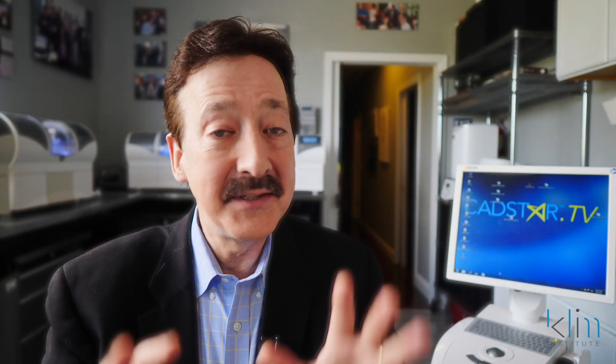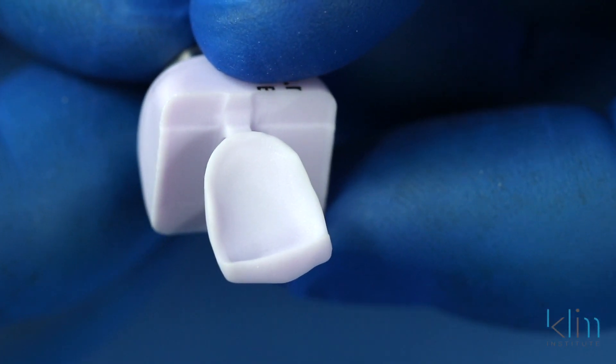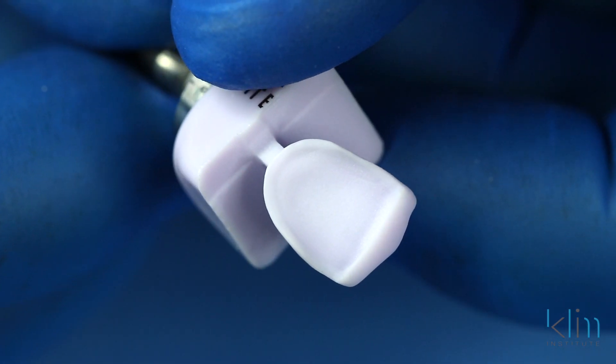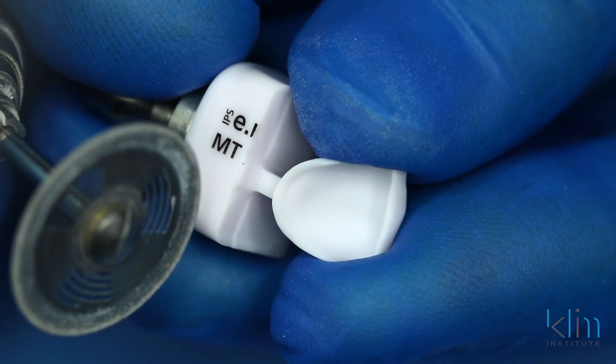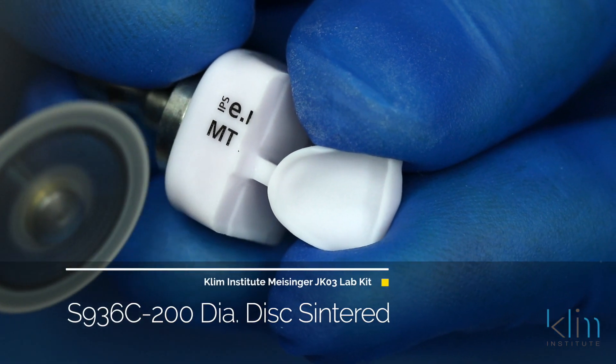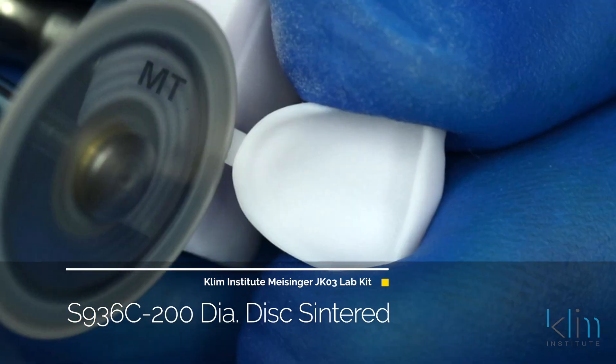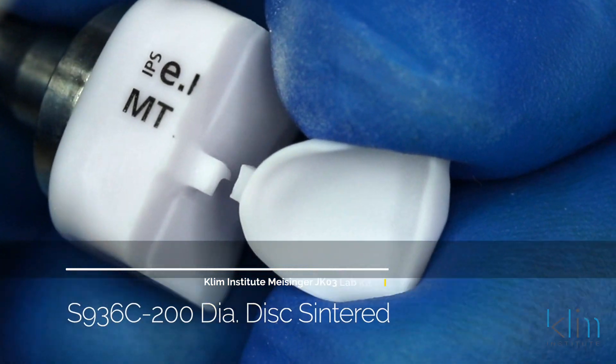Step one is to remove the sprue. On a veneer, it usually doesn't fall off on its own in the milling unit, and if it does, you're in trouble — usually it's going to chip. I like the separating disc on the JK-03 lab kit; it's a sintered diamond. Grab the veneer when you remove it, otherwise it may fly across the room and chip a margin. So grab the veneer with your fingers and carefully separate that sprue.